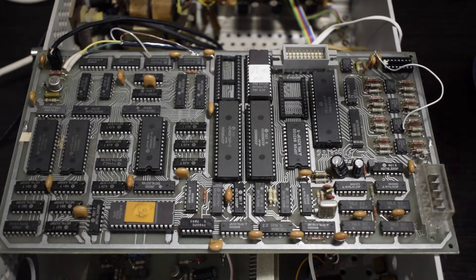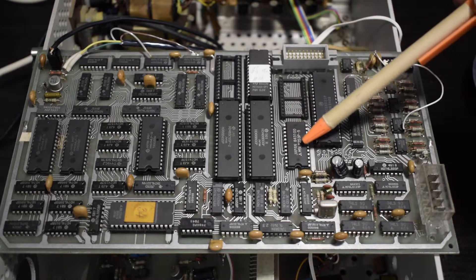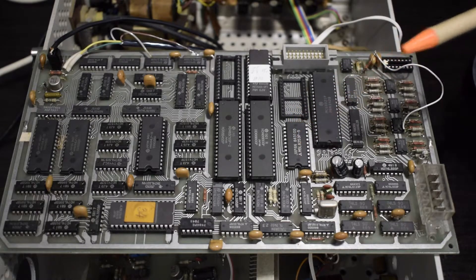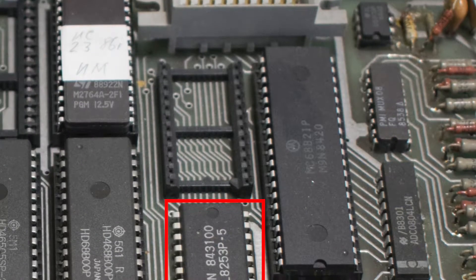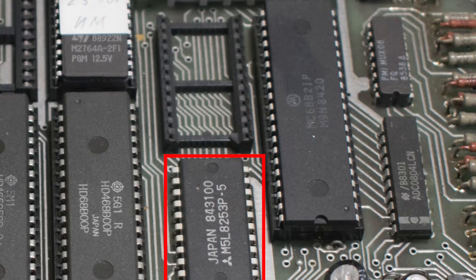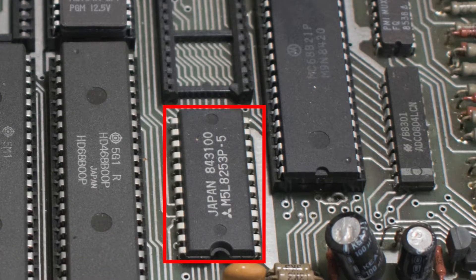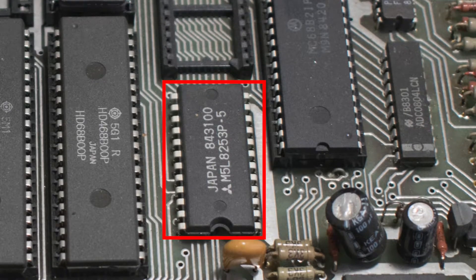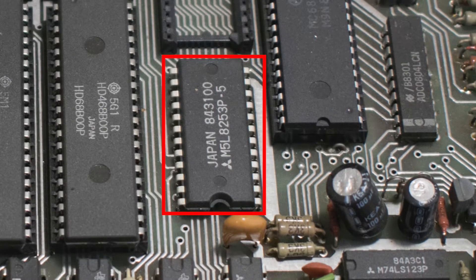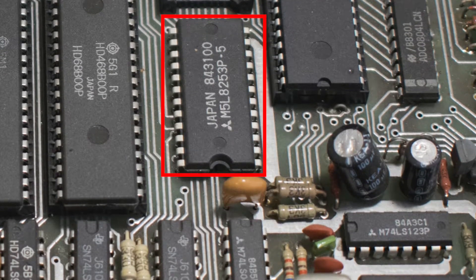Right between the micro and the peripheral interface controller there is a Mitsubishi M5L8253P-5 — this is a programmable interval timer. It is used to offload the CPU from timing calculations and functions, and there are a lot of timing calculations and functions in an electrocardiograph.